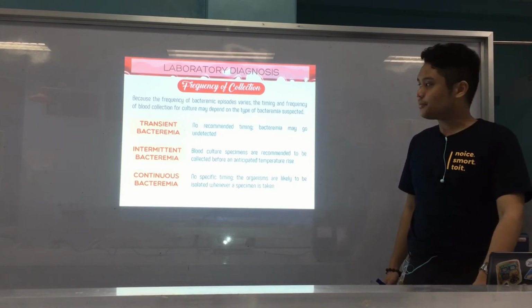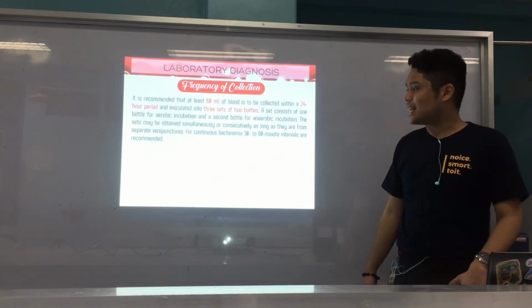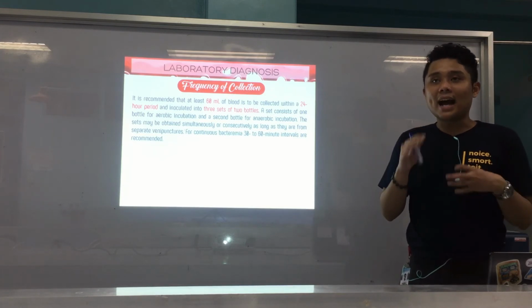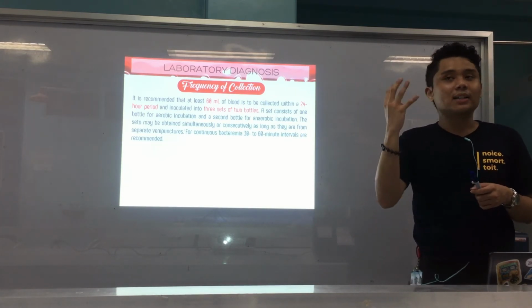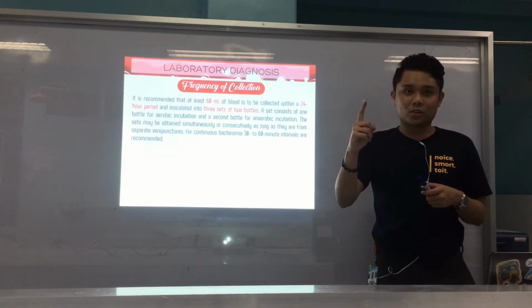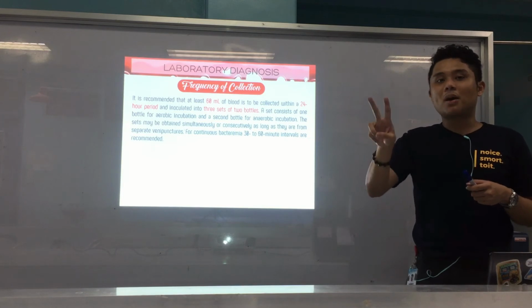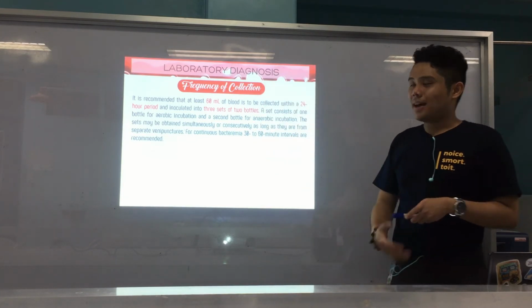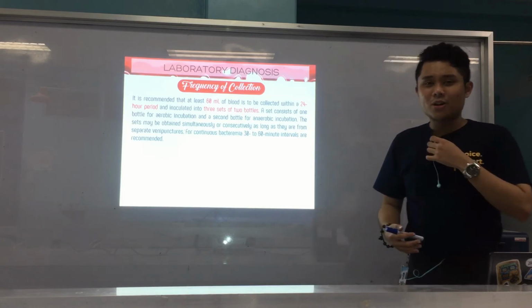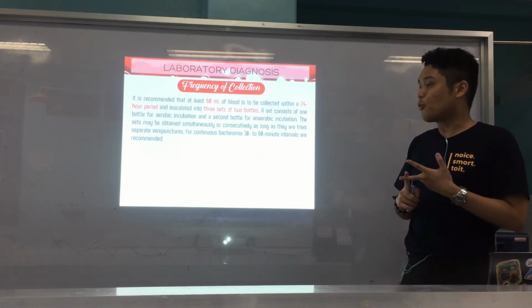All right? Okay. Again, recommended that 60 ml within a 24-hour set. Kay mag 3 sets man ta kada collect. And each bottle kay 10 ml. So therefore, 3 sets man, and each set contains 2 bottles. So 20 ml per set, so mao nang 60 ml. Alright, so 3 sets of 2 bottles. Ganu daw ka bottles? 1 for anaerobic, okay, and 1 for aerobic.